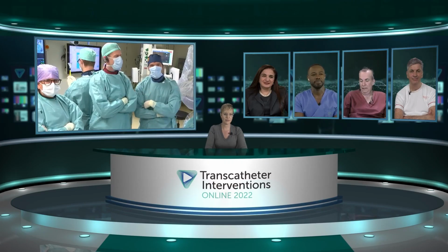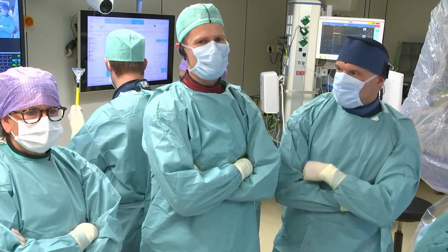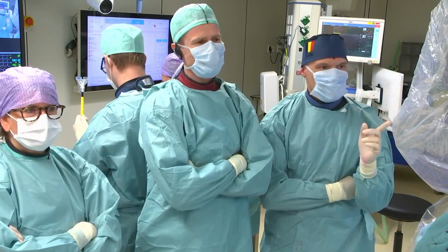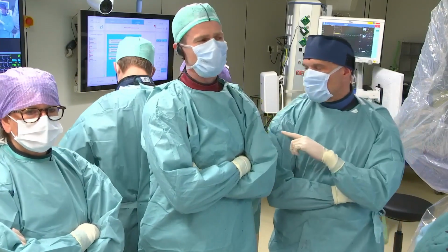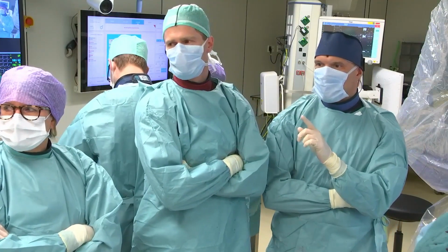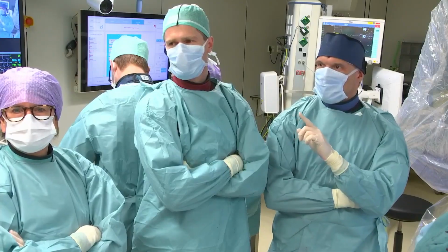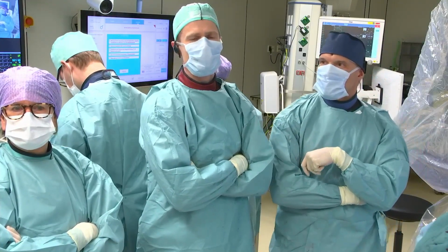Next to me is Rutger Jan Nuis, one of our senior structural interventionalists. There's also Mario, Sanna, E.T. or Tom, and Quintin in the back. There is Stefan, who is loading the valve as we speak. Claire is here for the echo follow-up. Claire is our expert imager. And there's also Rick Adrichem, one of our senior fellows, who will discuss the CT.